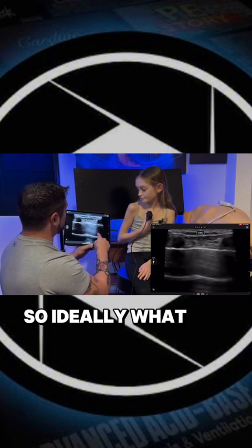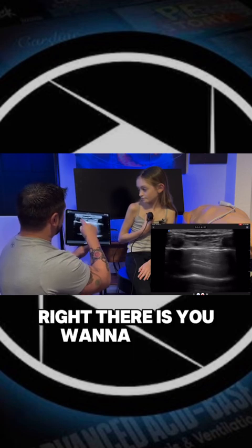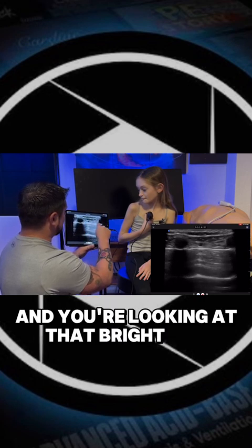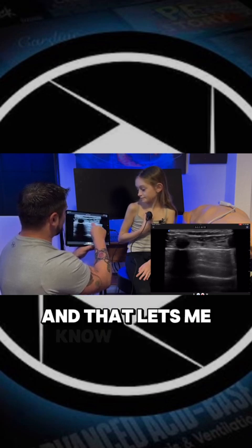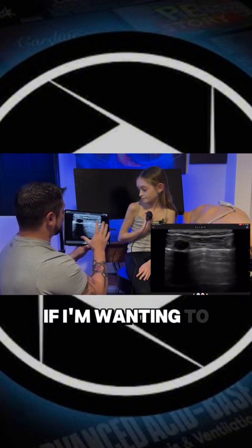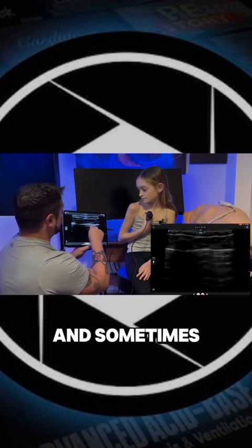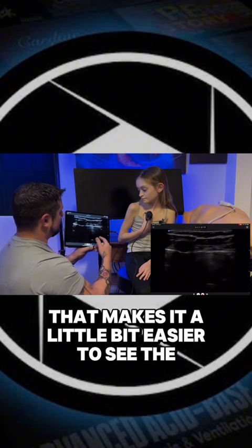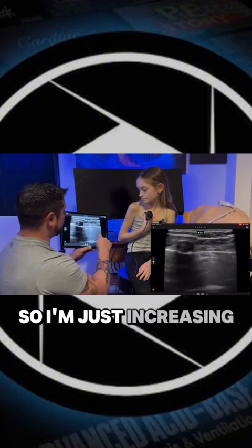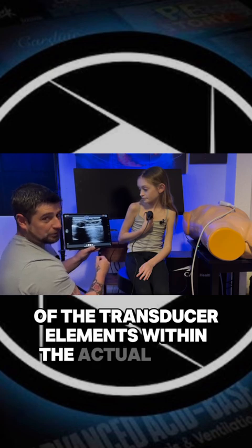So ideally, what you want to find when you're trying to locate the VPPI right there is you want to find a rib and rib shadow, and you're looking at that bright line right there. And that lets me know that I'm looking at the visceral parietal pleural interface. And then if I'm wanting to see the sliding at that point, then I can turn my gain down. And sometimes that makes it a little bit easier to see what they'll call ants marching or shimmering of that line. So I'm just increasing or decreasing the sensitivity of the transducer elements within the actual probe.